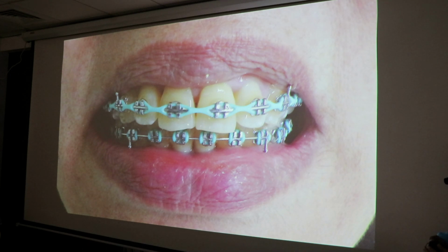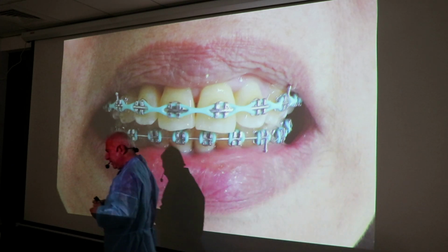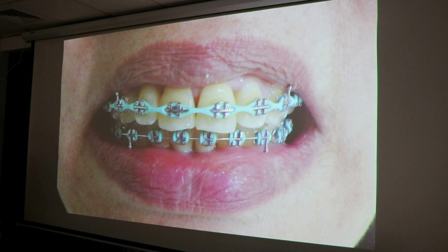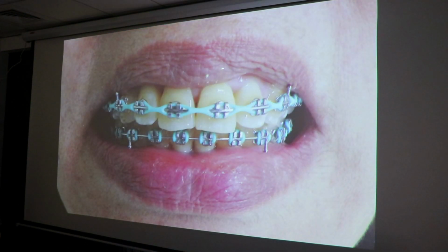What's the moral of the story? What do we get from this? Maybe I'll ask Sundar first what we get from this, and then everybody else will. So Sundar, what do you get out of this? This young girl, first of all, was not as tall as her father, and her father insisted on implant, and then we insisted on something very high tech with not much expense for the patient, but then it was not moving downward, and then we went on till the tooth started actually moving downward. So based on this case, what lesson can you give the audience?